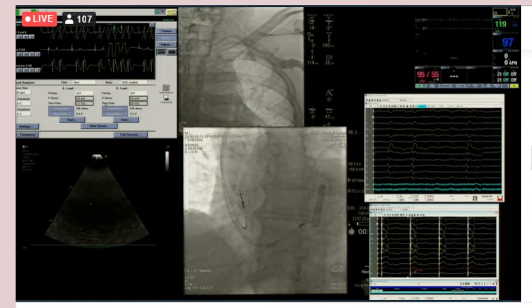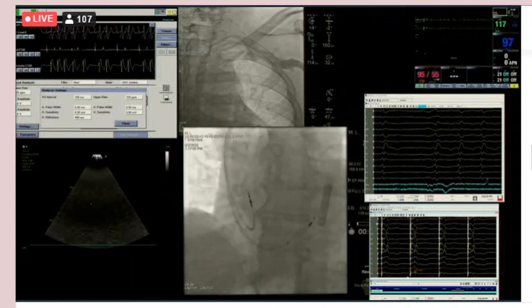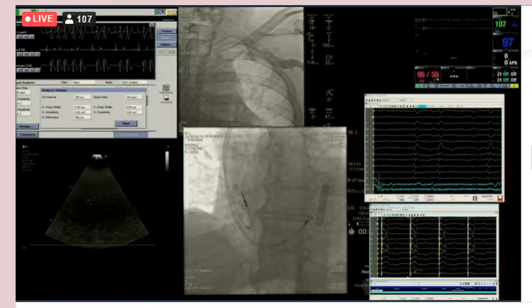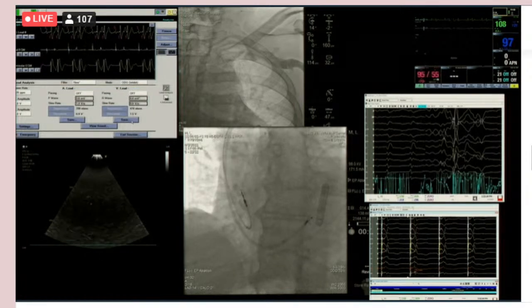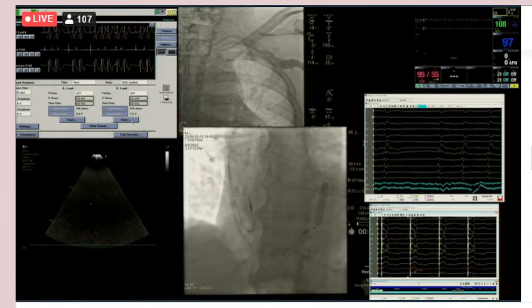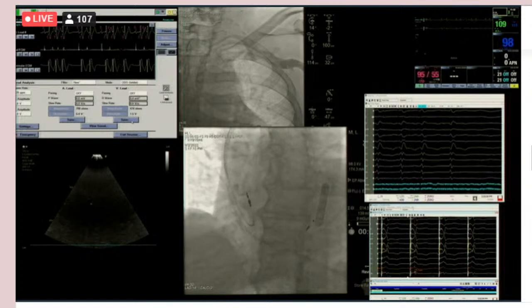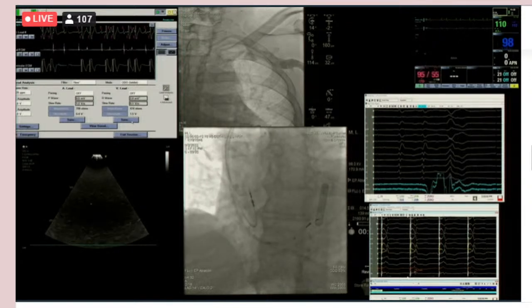Even with patients that have a cardiomyopathy and left bundle branch block, for a while I was doing both. I would put in left bundle pacing and a bipolar LV lead, connect them with a Y connector, and then choose. I'm not doing that anymore, but I feel I'm seduced by the QRSs that you can get with this technology, more so than with LV pacing.